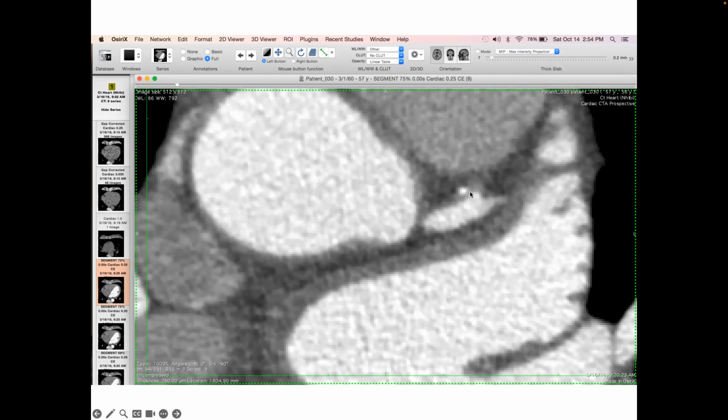So these little boxes tell you the rate at which you are displaying values for this image. A dimension of one of those boxes, let's say 0.5 millimeter, is one way of saying what the resolution of my picture is. Well, the pixels are 0.5 millimeter apart. However, the point spread function of your imaging system isn't necessarily tied to a sampling rate of 0.5 millimeter. This is just what's displayed here. You should always display your pictures with at least a few pixels inside the point spread function. You shouldn't have an image that is one box, a square that's lit up because your point spread function is inside that box. That's a bad idea. Use more pixels so that you see a blob, which is your point spread function.